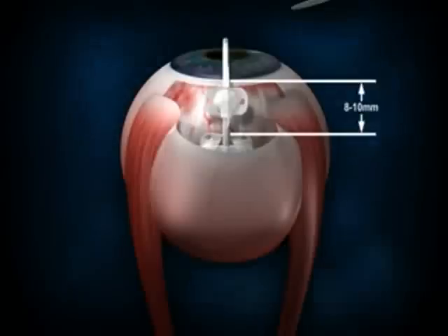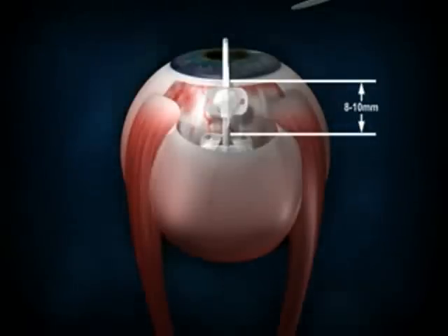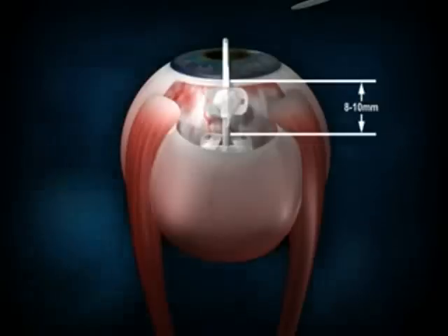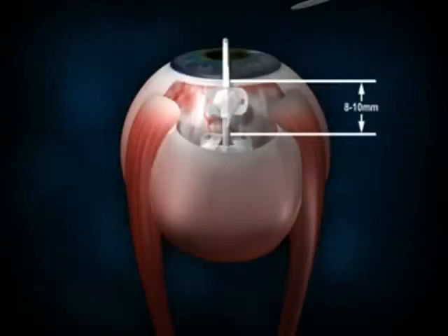If available, use calipers to be certain that the valve is well placed between the rectus muscles and that the anterior edge is actually measured at 8 to 10 millimeters away from the limbus.